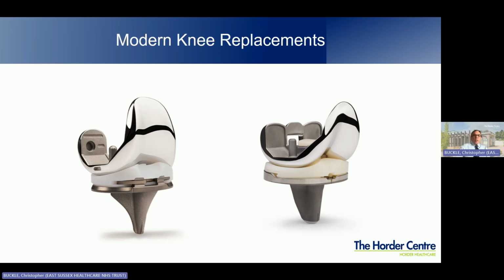Some of the subtle things you might see that have changed between these two knee replacements are the ability to change that bearing in size, but also the material it's made of. It's made of a harder wearing plastic surface, which potentially offers longer term solutions to the knee replacement wearing out. And so that is where we are in terms of designs of knee replacements. And I'd say the vast majority of those advances were made quite early on, and we've had subtle incremental change in their design over time.